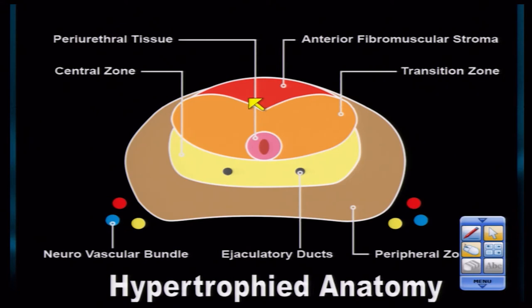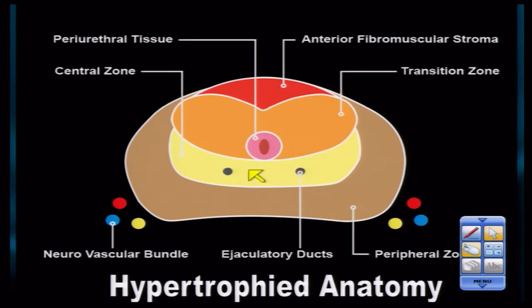Here's a magnified view of the axial projection, which is our hallmark projection for assessing prostate carcinoma, with the coronal and sagittal used to modify position and nomenclature. Here again we see the central region of the prostate containing the urethra, periurethral tissues, and glandular tissue. The transitional zone is now more enlarged in an older patient, and the central zone also gets bigger, though not quite as large. Together, drawn clearly in yellow, these make up the central region of the prostate.